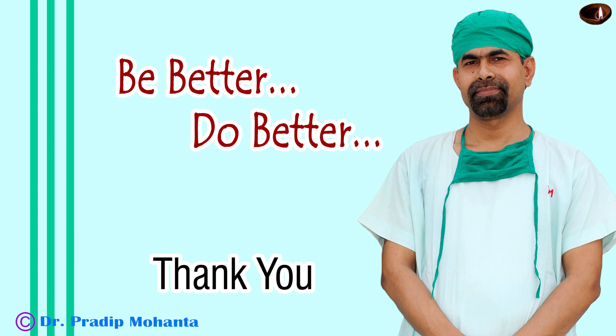Always keep the phaco needle at the iris plane and there will be no corneal edema in the postoperative period. Thank you very much for your attention.